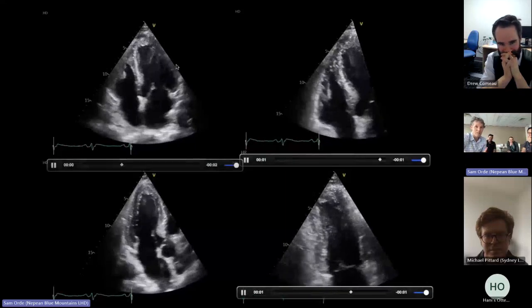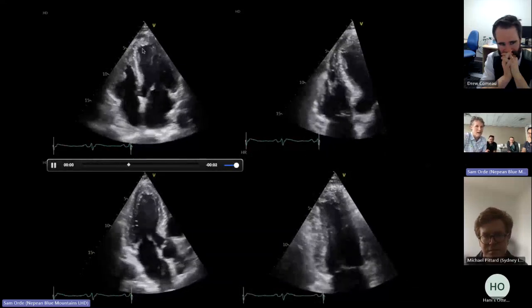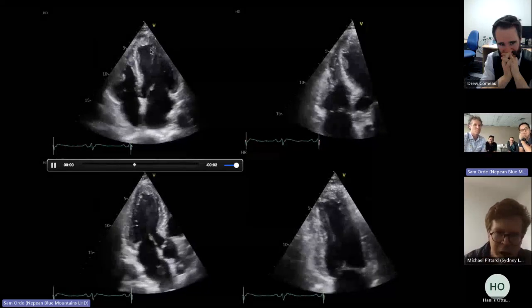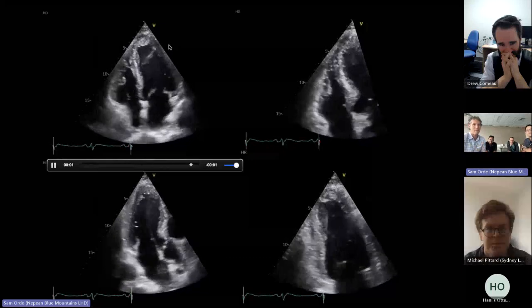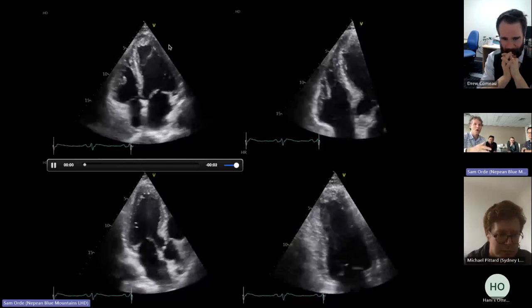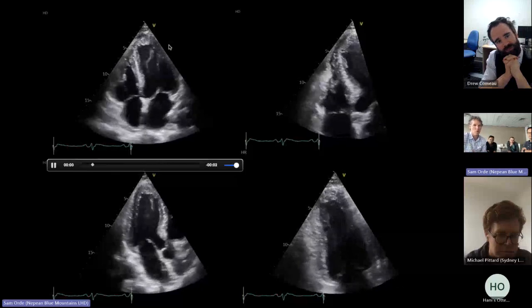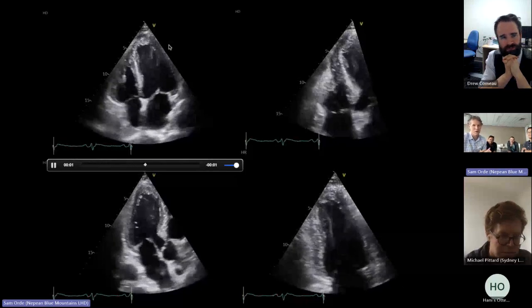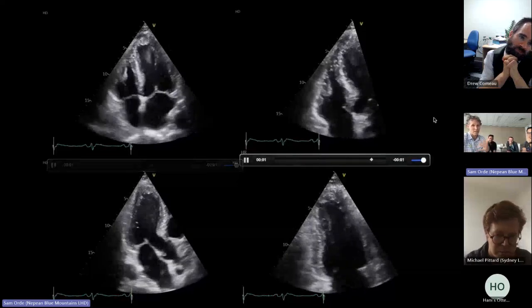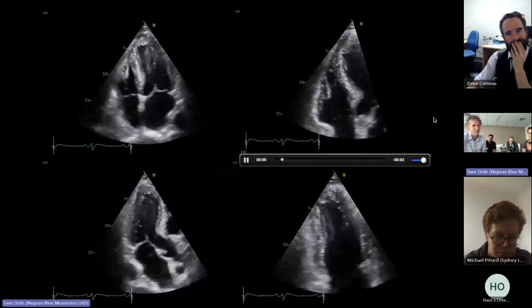Because you see this wispy smoke coming through, clearly a horribly akinetic apex, and that apex looks really weird. That is definitely suggesting that there is a thrombus in there. We've got that spontaneous echo contrast. Everything is ticking the box to suggest you've got a rip-roaring thrombus sitting up there. But are you sure you're not dealing with apical hypertrophic cardiomyopathy or a non-compaction kind of thing or something else? I think there's a lot leaning towards a thrombus, but it's a great example of when echo can be really useful to give you ejection fraction and regional wall motion abnormality. And let's have a look at this thrombus.